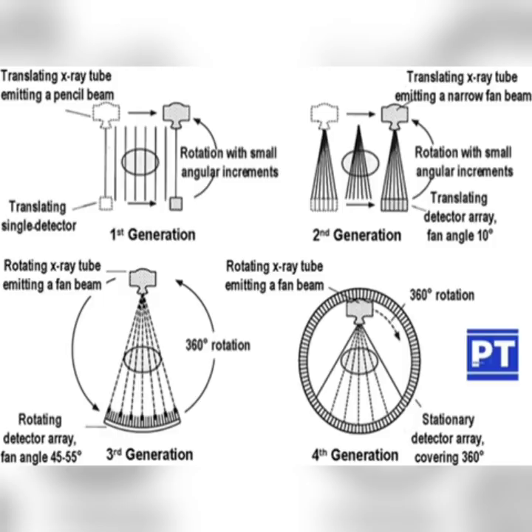Again, moving on to the third generation, you can see the X-ray tube as well as the detectors below and the fan beam. About 700 detectors are there, and a 360 degree rotation is shown. You can see the arrow up as well as the arrow down, which means it moves clockwise as well as anti-clockwise. Continuous rotation is not possible in the case of the third generation.